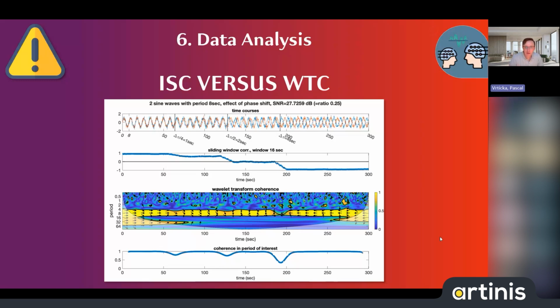What we can see here is that for correlation analysis, it is crucial to know the phase relationships between your data, because they will yield different correlation values. So usually you have to do these correlations for many different phase relationships, and you can't just do it over the whole data. The results will differ strongly, and that adds more comparisons which you then have to control for.